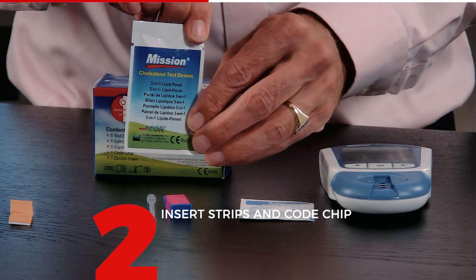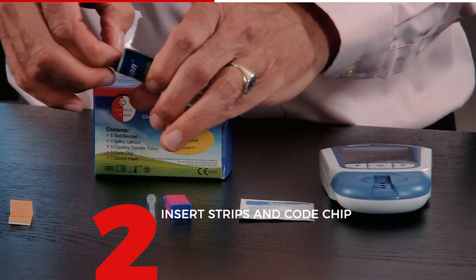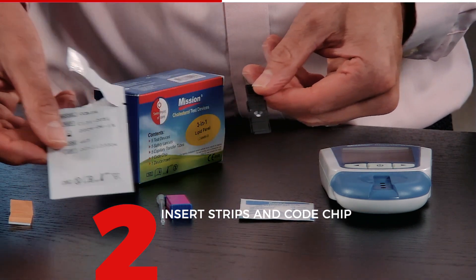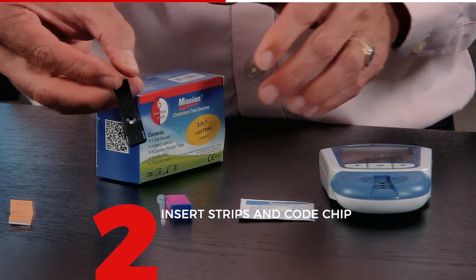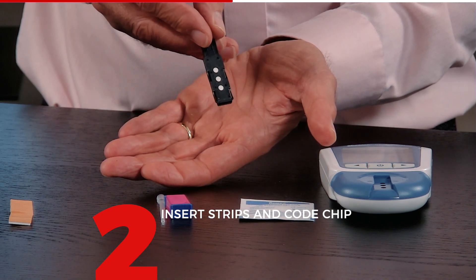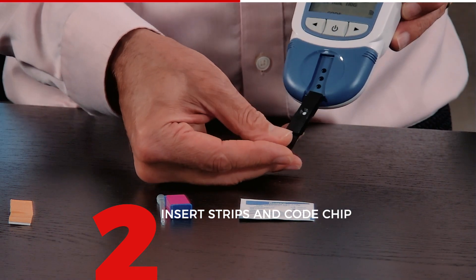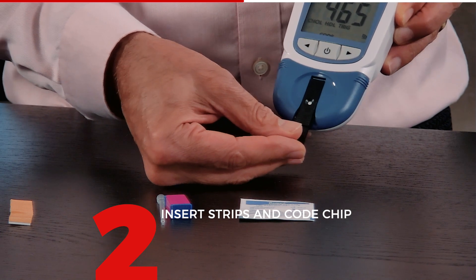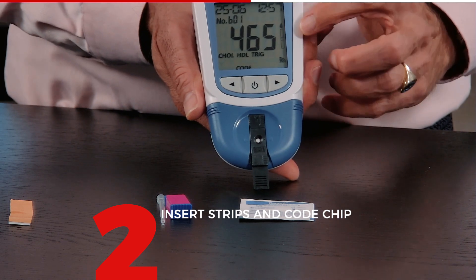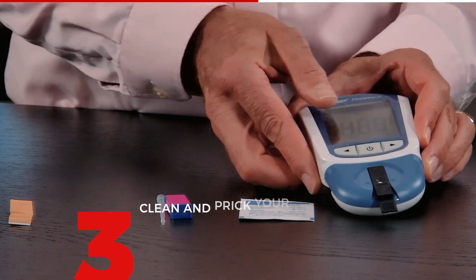Now I'm going to open the sachet and take out the strip. There is a desiccant inside against moisture — you can put that away. There are two sides to the strip: this is the top side, and this is the bottom side. Make sure you insert it the correct way. Insert the strip into the meter, and if you look carefully you will see a test strip icon blinking on the right. When the little blood droplet starts blinking, the meter is ready for use.